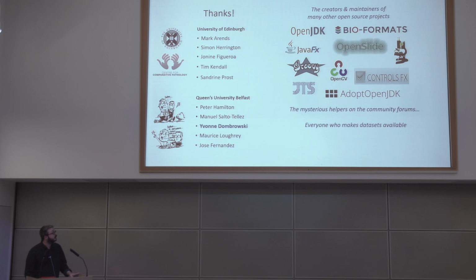And apart from that, I just want to thank some of the people involved. So this is some of the people I work with at Edinburgh and previously when I was at Queen's, developing in the first case. Yvonne, as I mentioned before, is my partner, the immunologist, and so I need to make her work on her images, and she's put up with me talking about it a lot more than anyone else has and anyone else should.